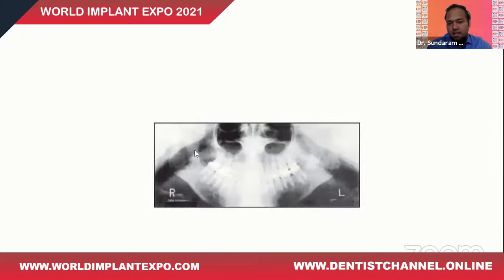Now this again, you can see it's an exaggerated smile of the patient. Again, it is because of improper angulation of the head of the patient. The patient has tilted the head more down, and that results in an image like this.